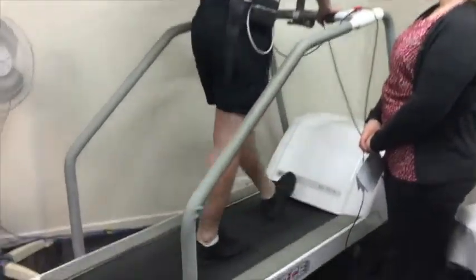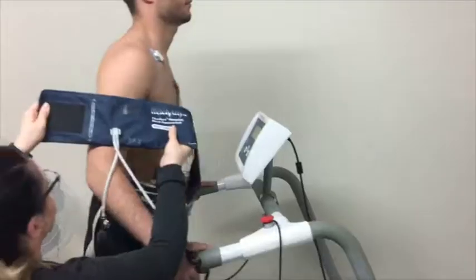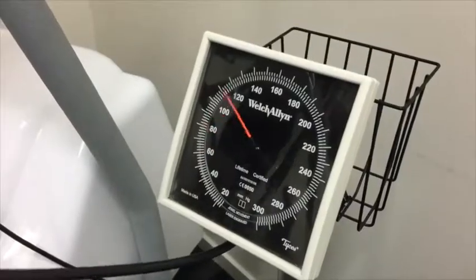The idea is to get your heart rate faster, close to its maximum target rate which is determined by your age. Your blood pressure will be measured a few times during the test, and your ECG will be continuously monitored throughout.